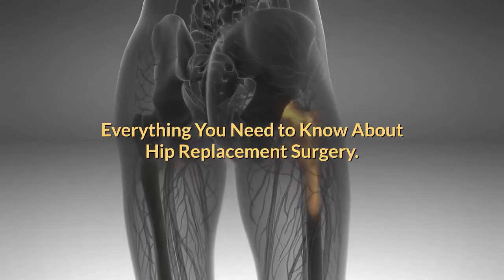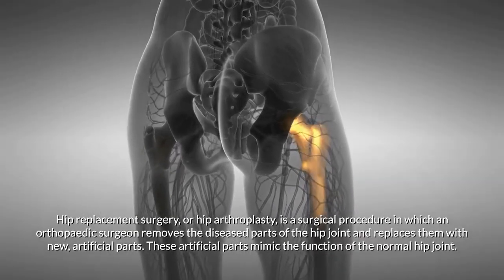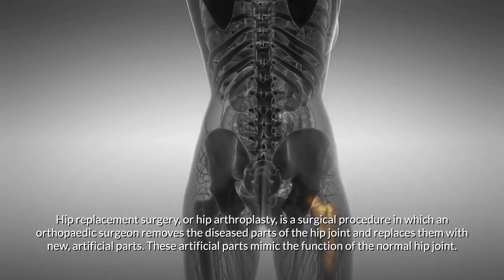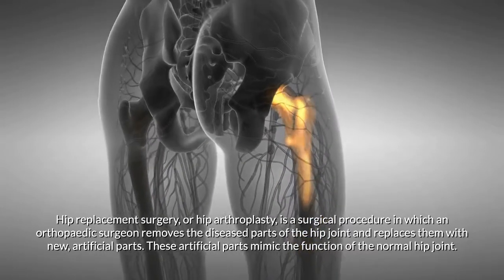Hip replacement surgery, or hip arthroplasty, is a surgical procedure in which an orthopedic surgeon removes the diseased parts of the hip joint and replaces them with new artificial parts. These artificial parts mimic the function of the normal hip joint.